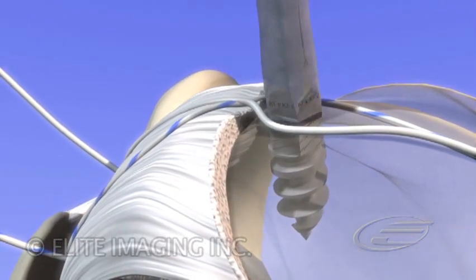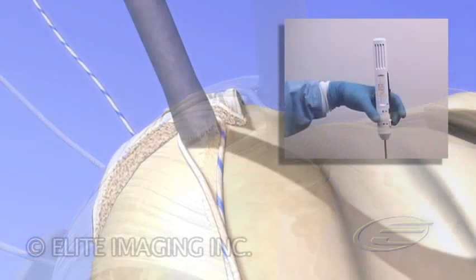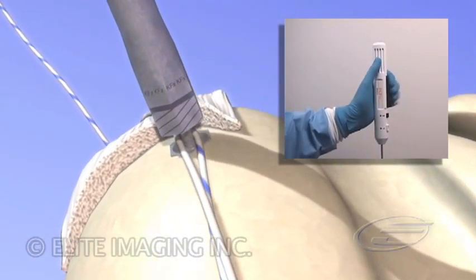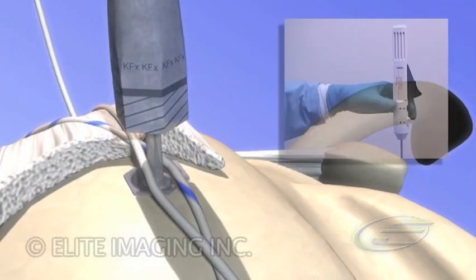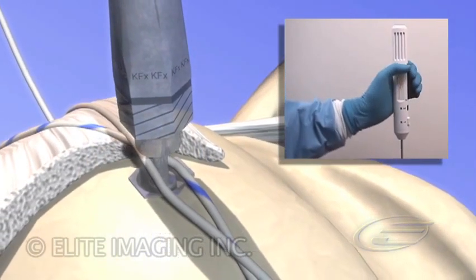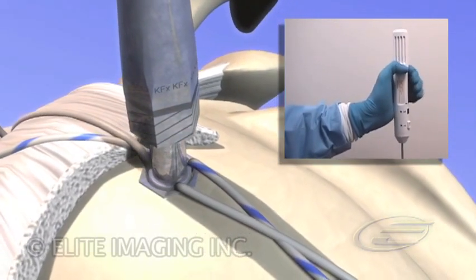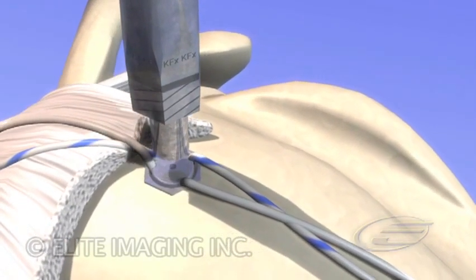The knotless suture lock mechanism is then activated, creating a channel into which the sutures from the medial anchor will be locked. The surgeon then squeezes the insertion handle trigger to close the anchor channel and lock the sutures in place. The insertion handle is then removed.